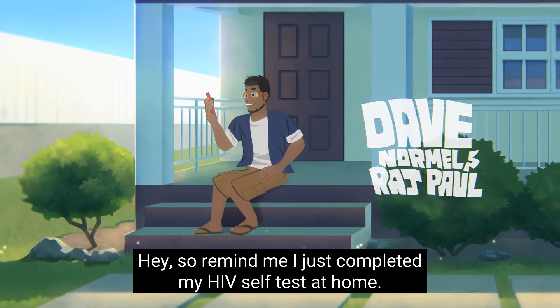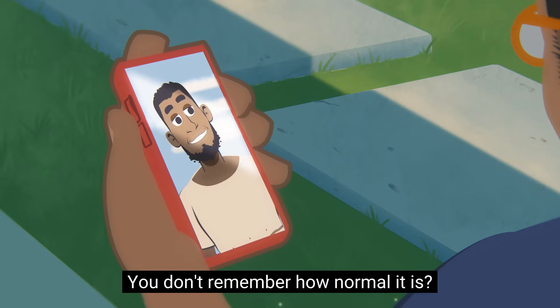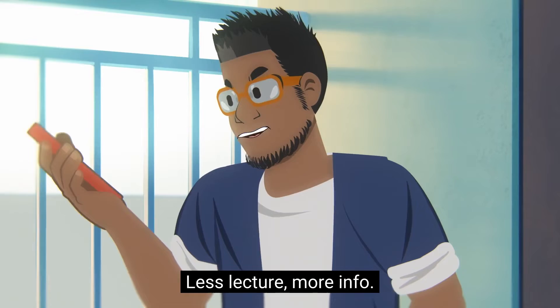Remind me — I just completed my HIV self-test at home. How to interpret the results? You don't remember how normal it is? Less lecture, more info.